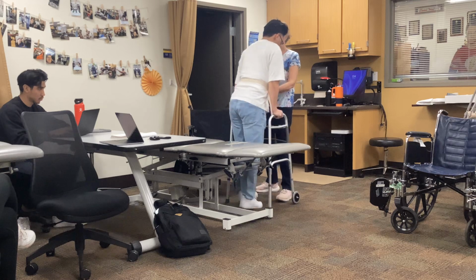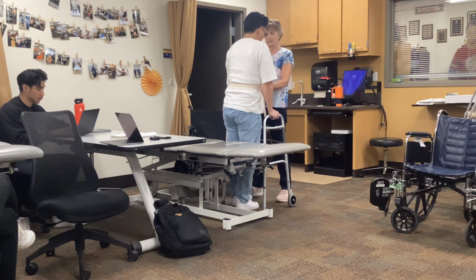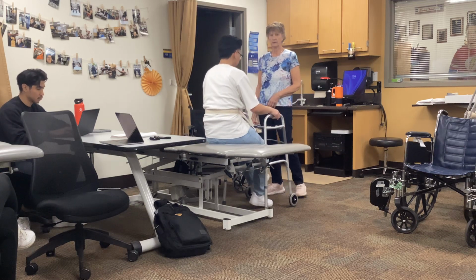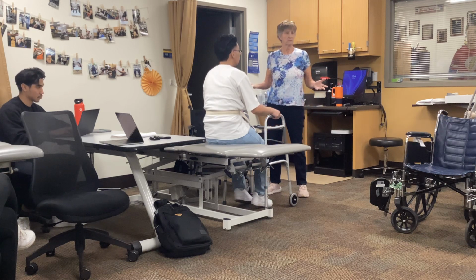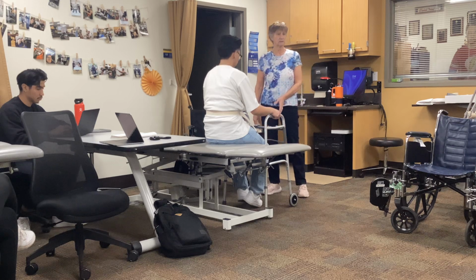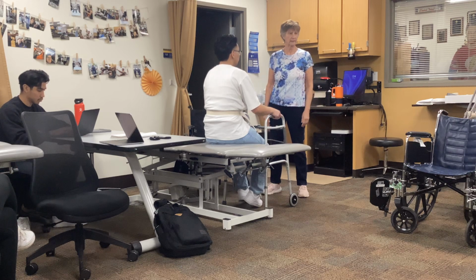Okay, bring the walker back. Now same thing, hop back till you feel the treatment table on the back of your leg. Did you feel it? Yes. Okay, now what are you going to do? I'm going to lower myself and use the table as support. And he kept his leg out as well. That would be the same whether it was partial weight bearing, toe touch weight bearing, or non-weight bearing. Even if he's weight bearing as tolerated but using an assistive device, we're going to go towards the stronger side. All the other rules apply for how to stand up and sit back down safely.